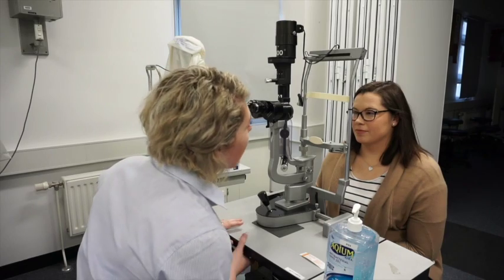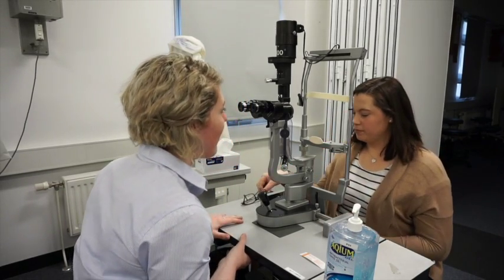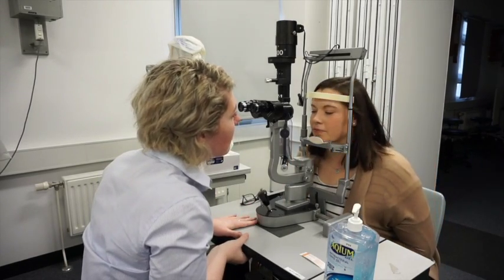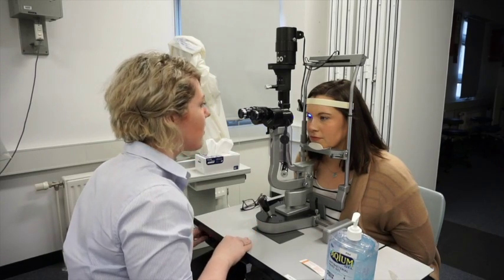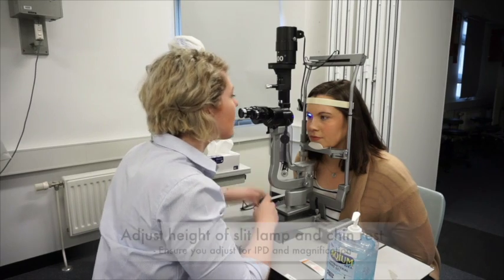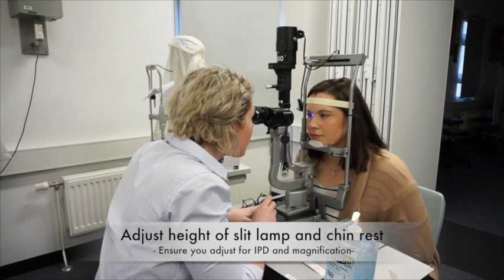The patient is asked to remove their glasses and place their chin against the chin rest and forehead against the bar. The orthoptist will then turn on the slit lamp and adjust it to a suitable height for the patient, using the chin rest knob and the table lever.